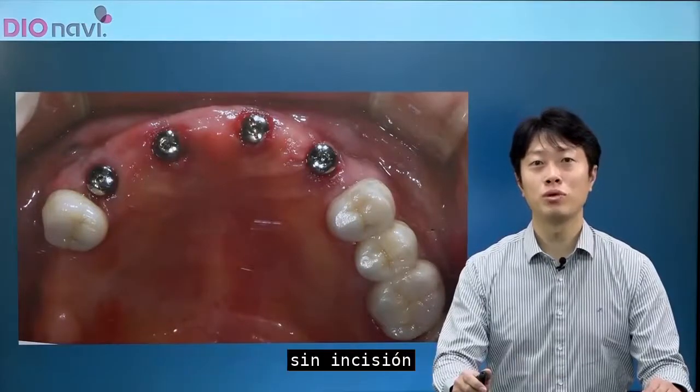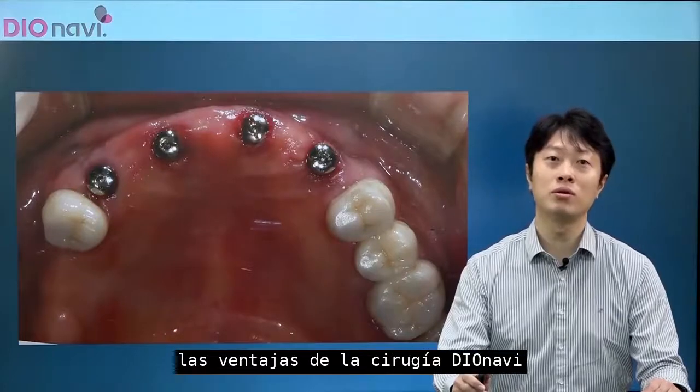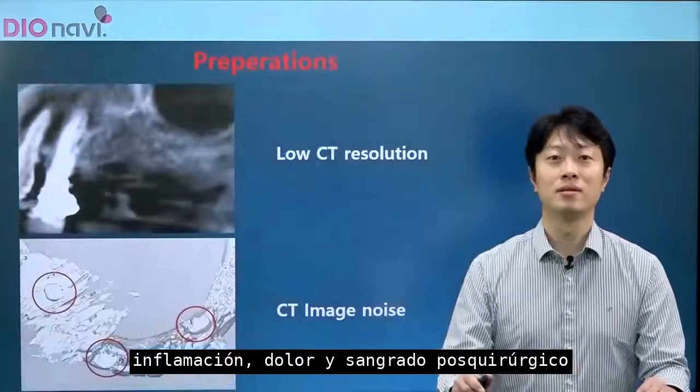Usually, guide surgeries are done without incision. The advantages of DIOnavi surgery involve significantly less post-surgical bleeding, swelling, and pain.